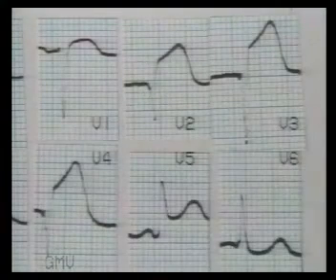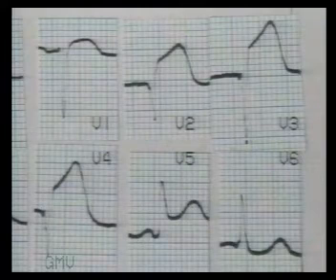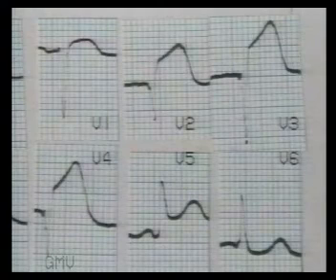The chest leads show ST elevation from V1 to V5. So this is an extensive anterior wall infarct. Note in V3 ST elevation of more than 5 millimeters.